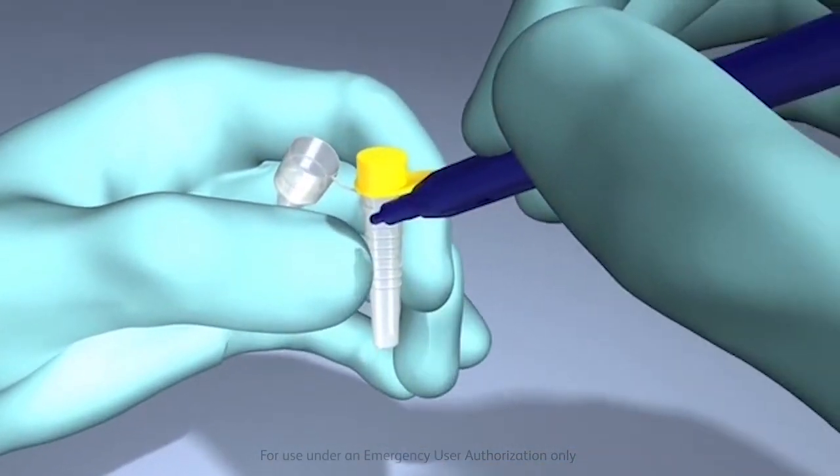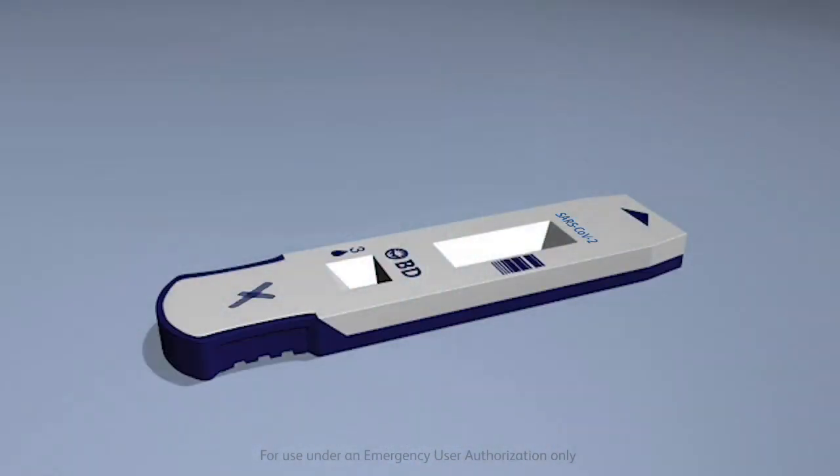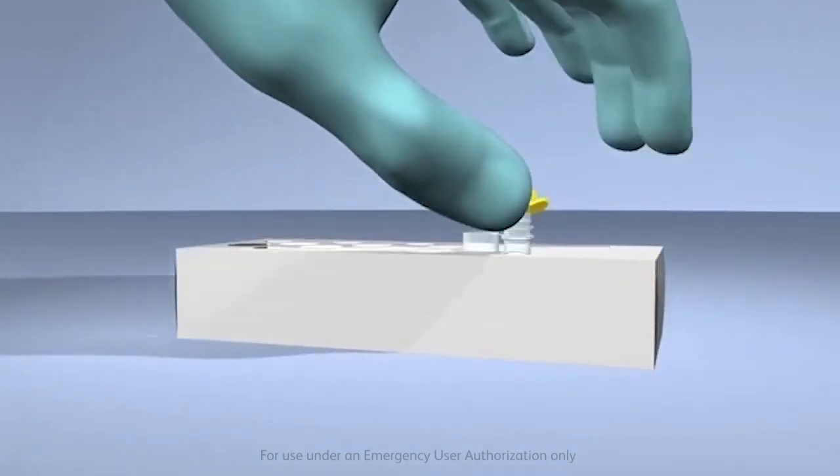First, label the unitized tube and the BD Veritor Plus test device for the specimen to be tested. Place the labeled unitized tube or tubes in the designated area for your workstation or rack until you are ready to process the sample.